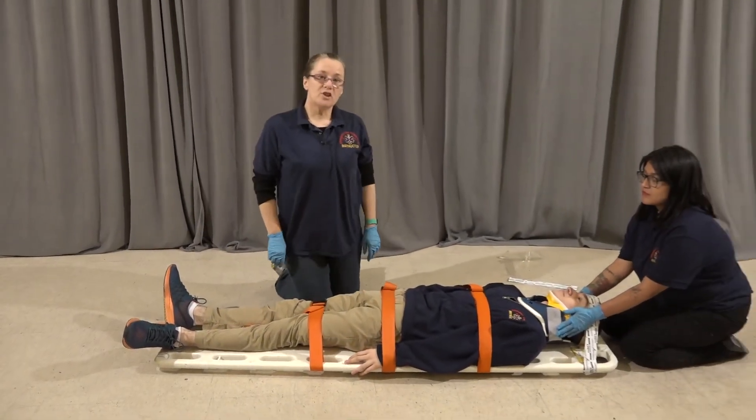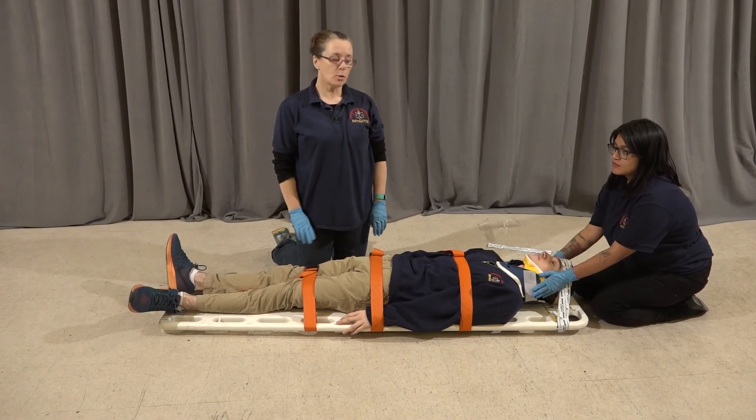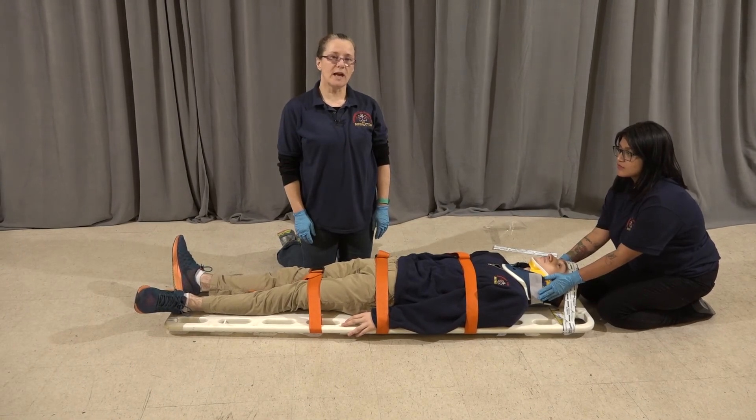I'm ready to move the patient now onto the stretcher. We're going to lift him and put him on the stretcher. Once he's on the stretcher, we're going to remove him from the backboard, leaving the collar on. And at that point my partner can let go of the head.